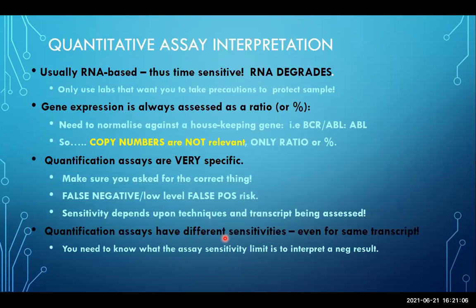Okay, so now when it comes to quantitative assay interpretation, this is usually RNA based, and thus time sensitive. RNA degrades very fast, and different transcripts don't degrade at the same rate. Some are incredibly stable, but a lot of them are not. So you need to take some kind of precaution to protect your sample, whether that is a PAXgene tube or time and refrigeration. Those things help limit the degradation, but it's not foolproof. And unfortunately, you can have problems here.